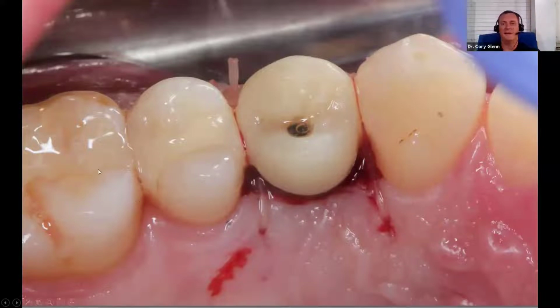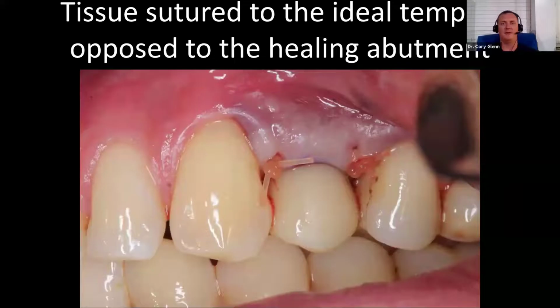He was doing great. And I'll do Facebook video messenger with him periodically from Hawaii, and he's just eating everything in sight with it. It all went perfectly. He's had no issues whatsoever. It's all integrated. So I just thought that was an impressive workflow to be able to guide the implant, place it, and deliver the final restoration on the same day, and the accuracy be so good that everything would fit. That really, to me, attested to the power of guided surgery and the Blue Sky kit, as well as these softwares, the guided software and the crown and bridge.